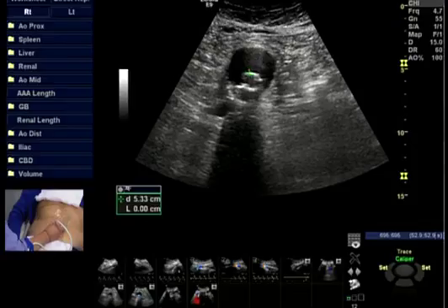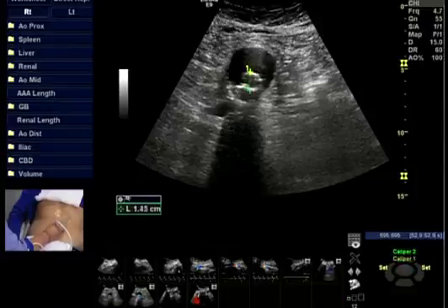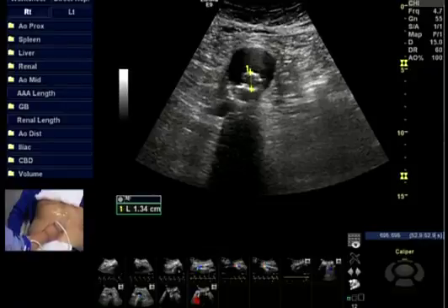We confirm actually the limb size. We go in a cross-sectional view. We will go ahead and confirm that the limbs have not made any changes. It would be very surprising since these particular limbs have a metallic structure, but about a 13 millimeter limb size, which I'm sure is what was implanted in this patient if we went back and reviewed the operative report.